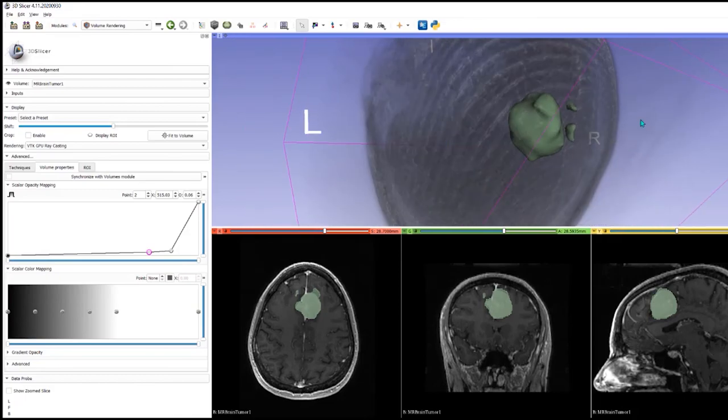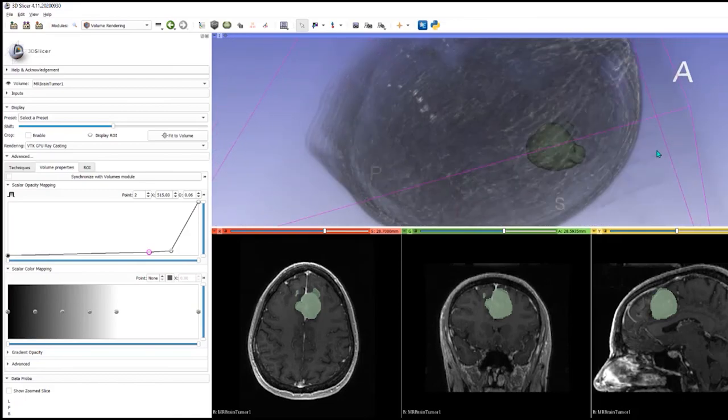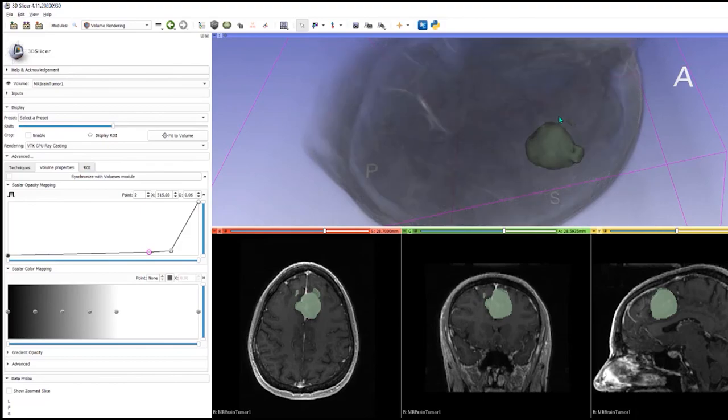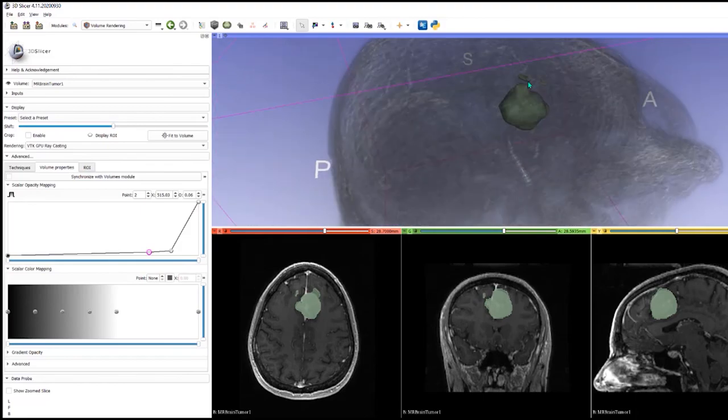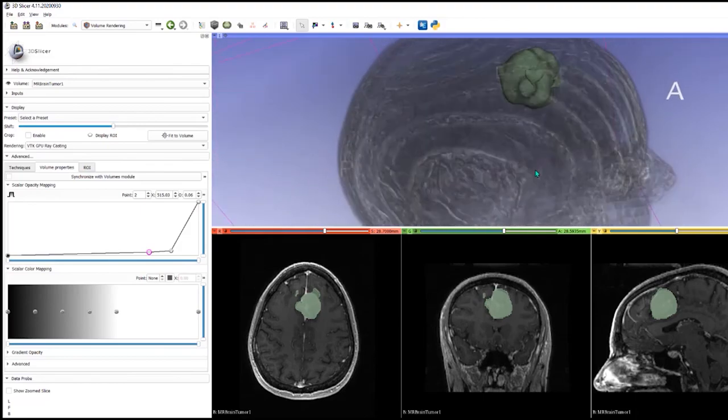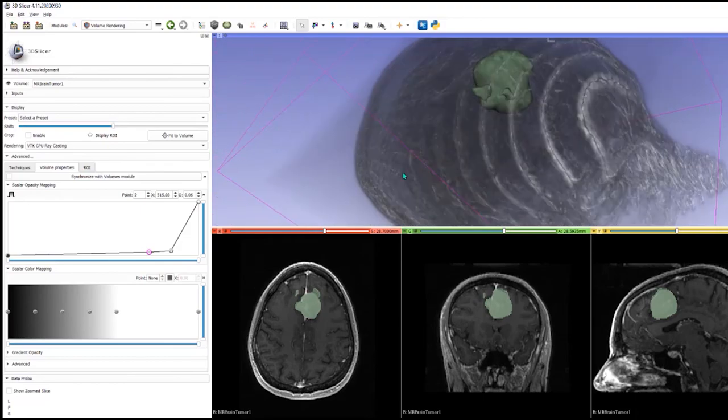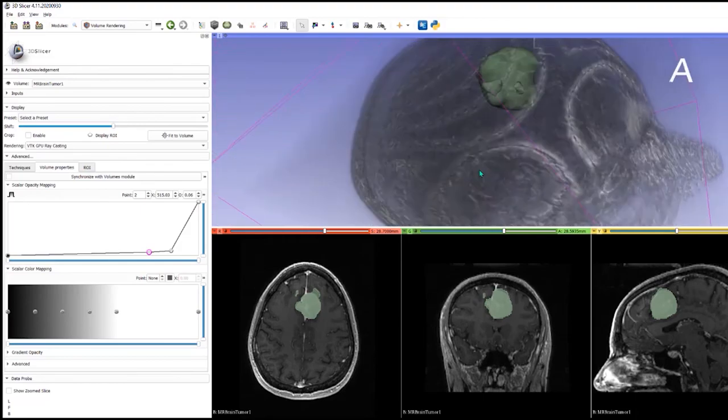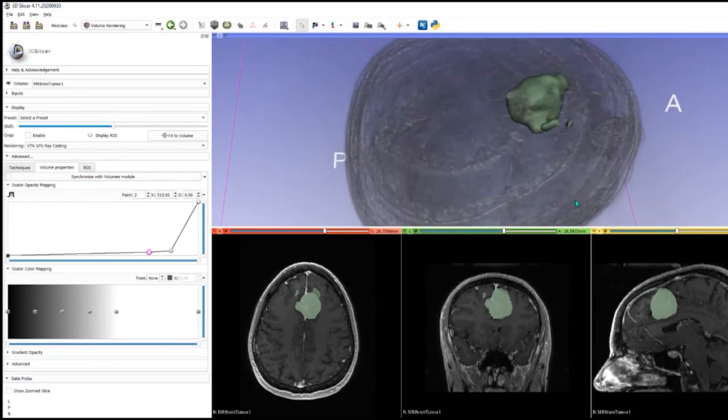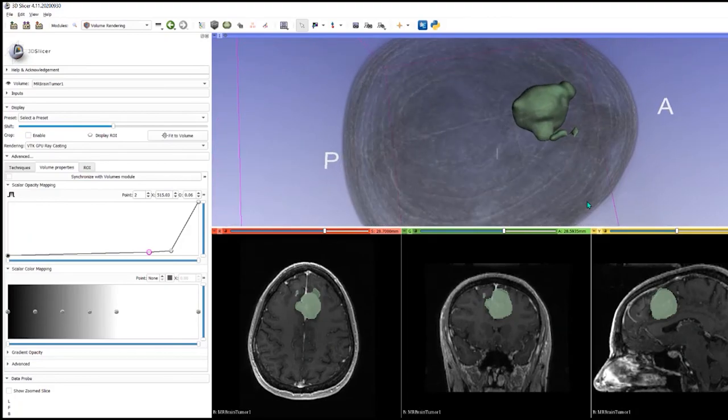So that's using an AI, an NVIDIA AI module, to segment a brain tumor. I think it does it rather well.